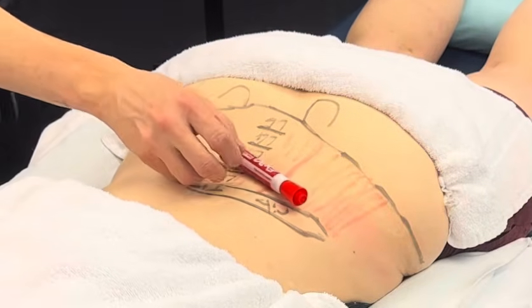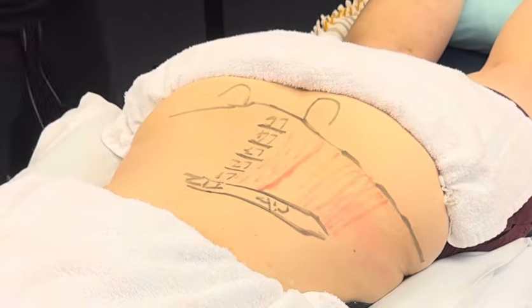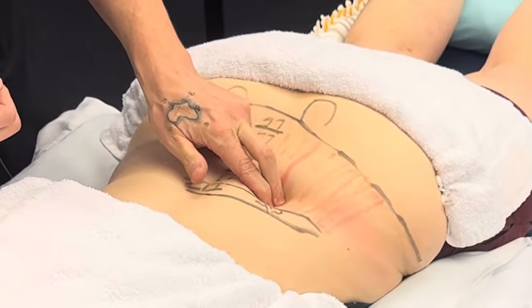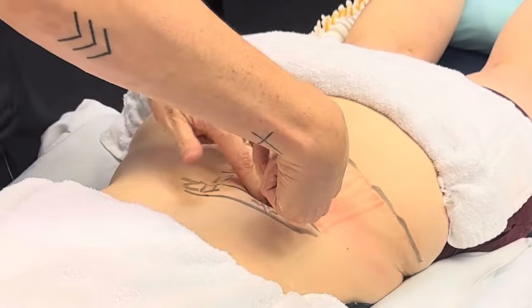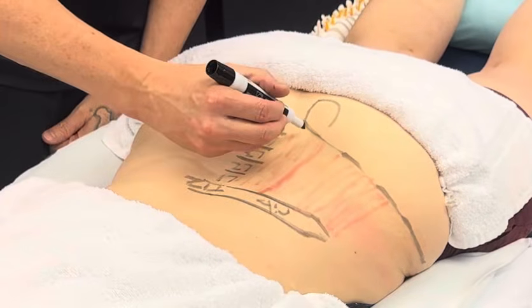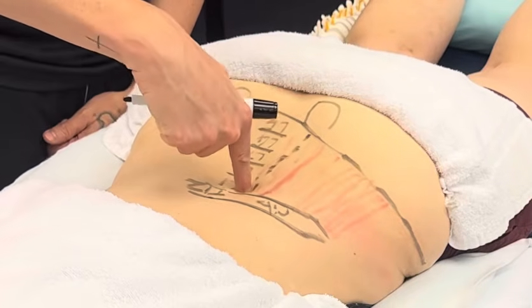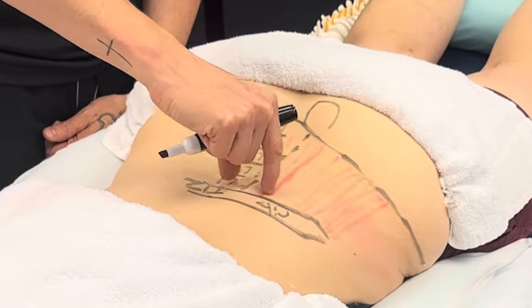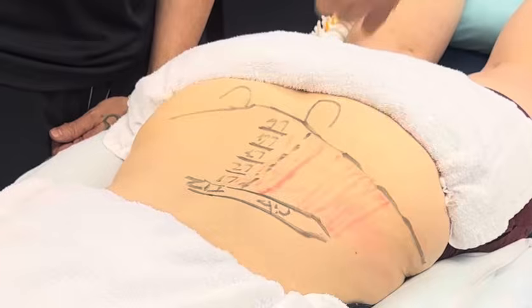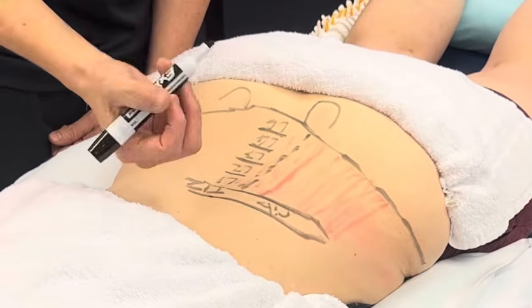So let's go ahead and show the paraspinals, which is also gonna give us multifidus. I like to needle the edge of paraspinals and just needle in like 45 or 60 degrees like I told you. If you wanna be extra safe, like this half is super safe, you can just go straight, right? If you look at the paraspinal layers though, you're gonna hit a little bit more if you do that diagonal needling, okay? And that'll guarantee that we hit multifidus, but up to you.